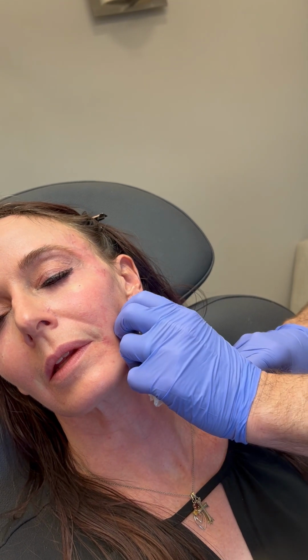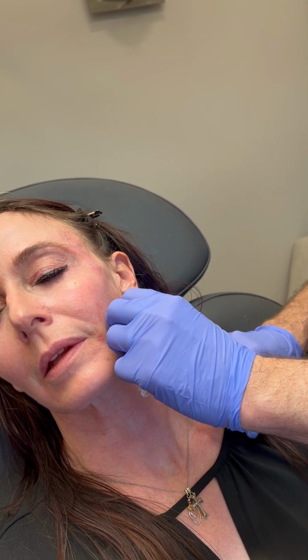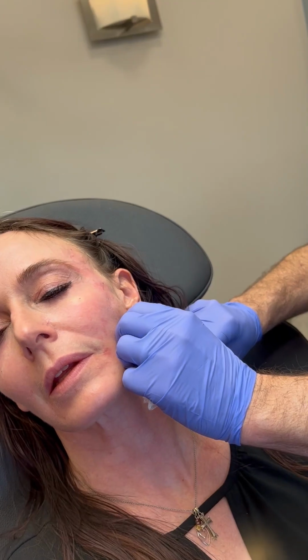We got a little resistance, so we'll try to clear that. Sometimes it does clog the needle. You can see it's clogging, and keep going.